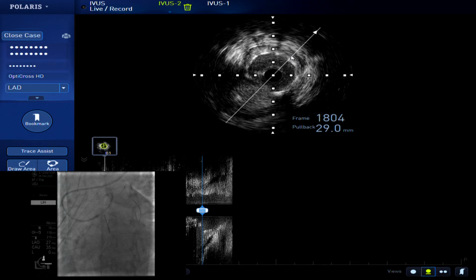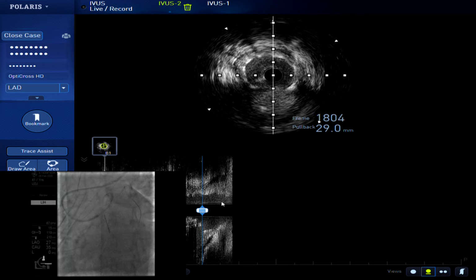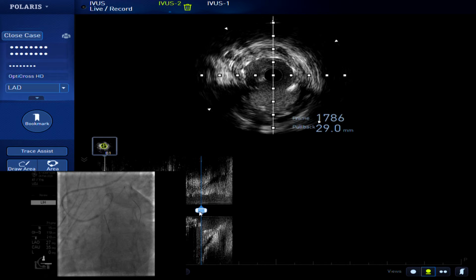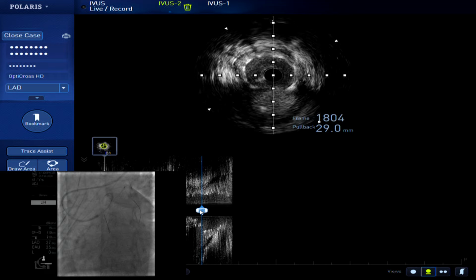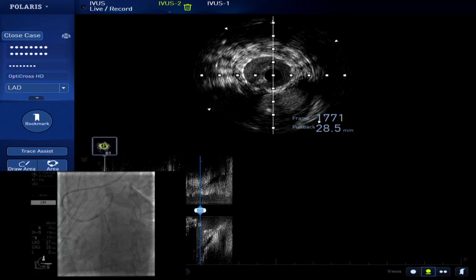I think so, yes. So now I want to take the 3.0 balloon and the 2.5 millimeter balloon together, okay? 3.0 sizes? Size, length? 15. 3.0 by 15 and 15 as well. Both 15. 3.0 by 15, 2.5 by... What do we have? This is 2.5 by 6. Okay. So first I want to close that diagonal. Okay.